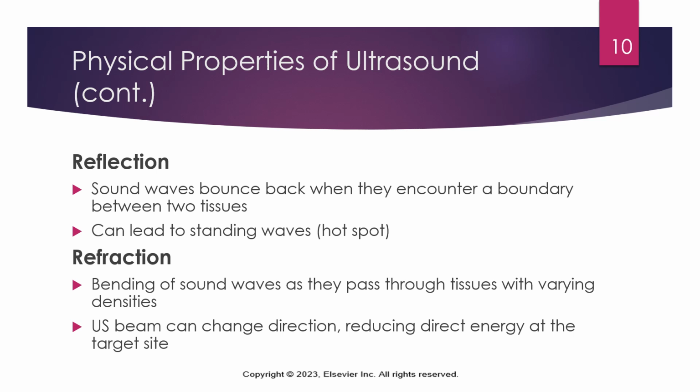This just means that the ultrasound beam can change directions and it could possibly reduce that directed energy at the target site. So we want to be really aware of that. We may be getting less energy at the target tissue than what we thought due to this refraction.